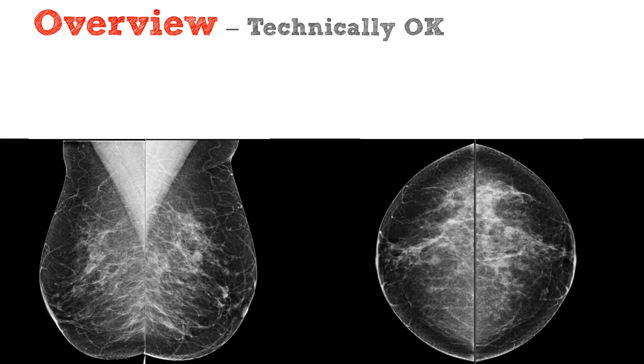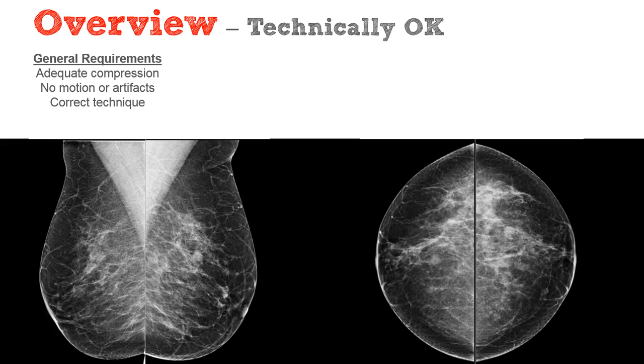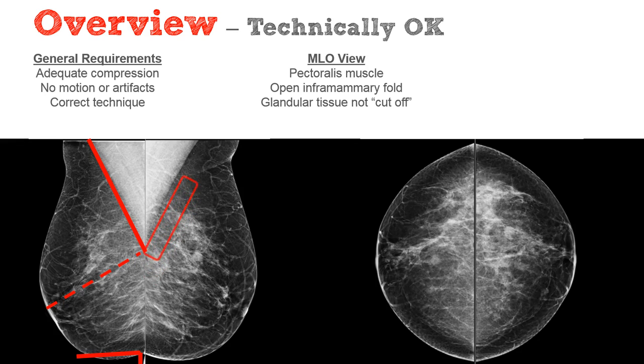So here we go. First, you want to start by making sure that images are technically okay. A few general requirements. You want to ensure adequate compression, no motion or artifacts, and correct technique. The images aren't too dark, they're not too light. Next, on the MLO view, you want to look and make sure the pectoralis muscle goes down to the level of the nipple. Next, you want to ensure that the inframammary fold is open and not drooping. Next, you want to make sure that the glandular tissue is not cut off posteriorly.